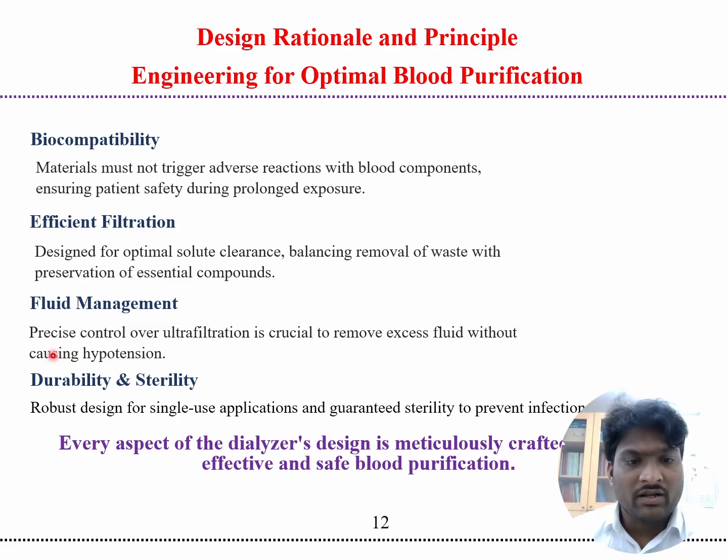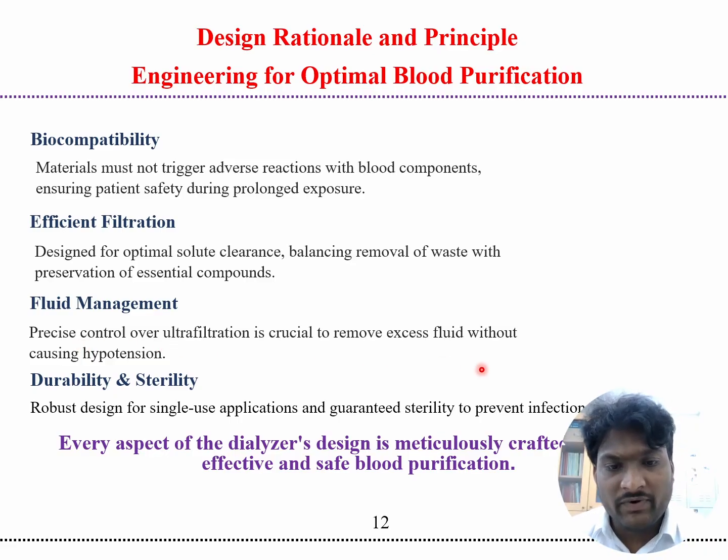The fluid management, like precise control over the ultrafiltration, is crucial for removing the excess fluid without causing hypotension. And durability and sterility: robust design for single-use applications, and guaranteed sterility to prevent infection. Every aspect of dialyzer design is meticulously crafted for effective and safe blood purification.